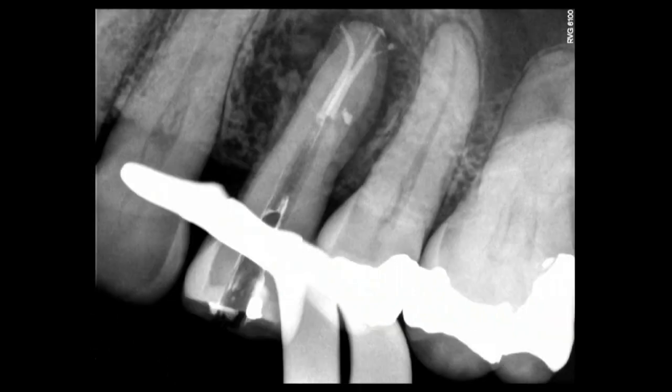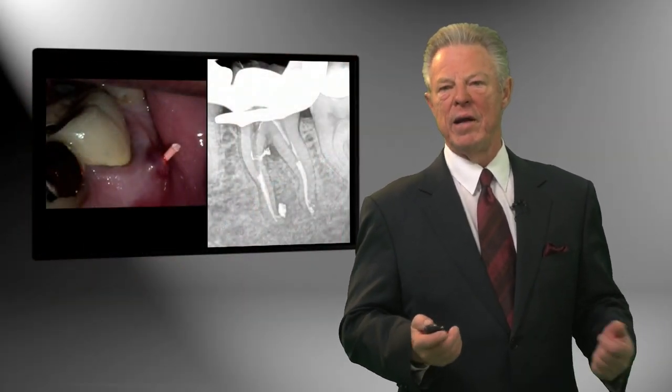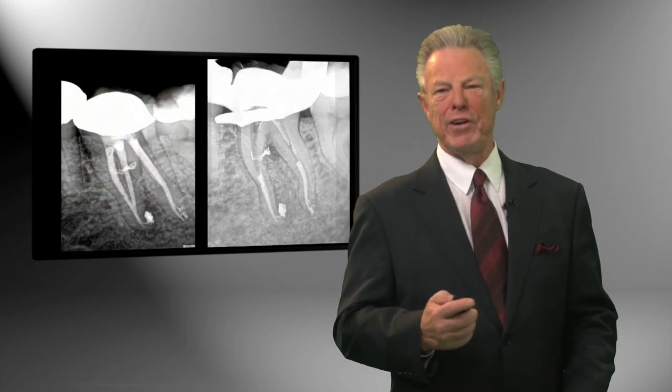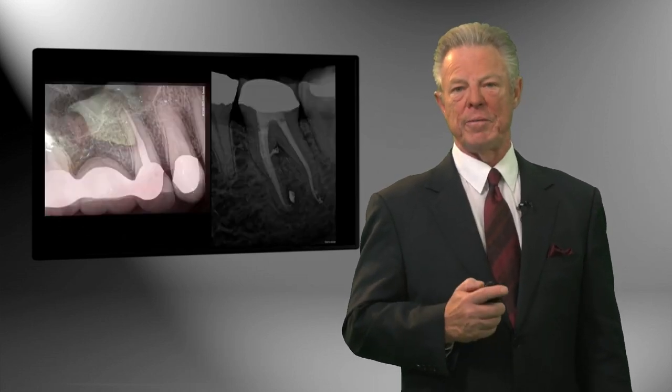Here's the cone fits, the down pack. And notice these are simple shapes, and yet they appear elegant, appropriate, not too big, not too small, just right. I've said that a few times because the next files allow us to often do it just right if we follow the directions. And then this patient, there was a sinus tract trace to the furca. On the right is the down pack. I want you to focus on the shapes. There's an oblique view of the finish, and here's the patient a few months later healing in the furca, and the sinus tract has closed as it predictably would.